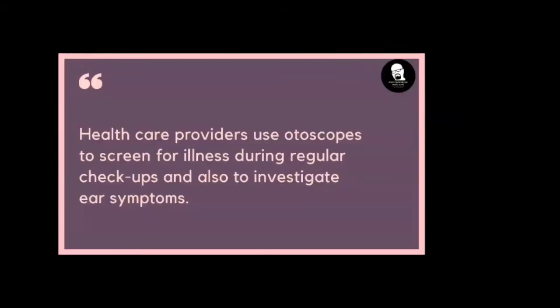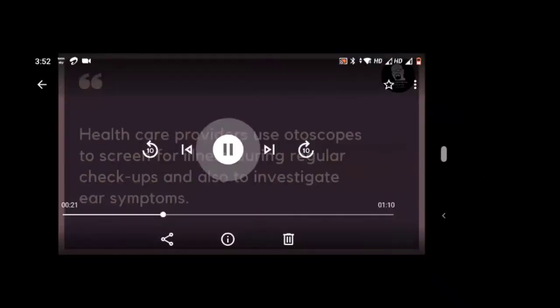Just see. So a small clarification. Healthcare providers use an otoscope to screen for illness during regular checkups and also to investigate ear symptoms. Whatever the symptoms may be, at the first checkup the doctor may use this particular otoscope to diagnose.